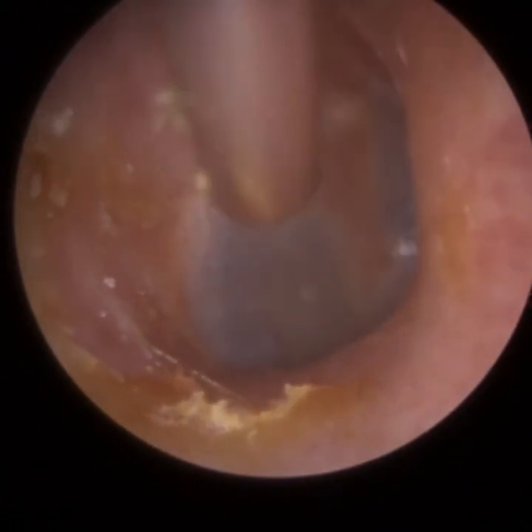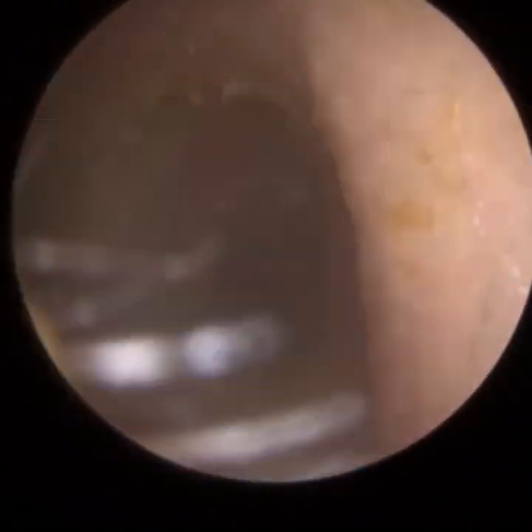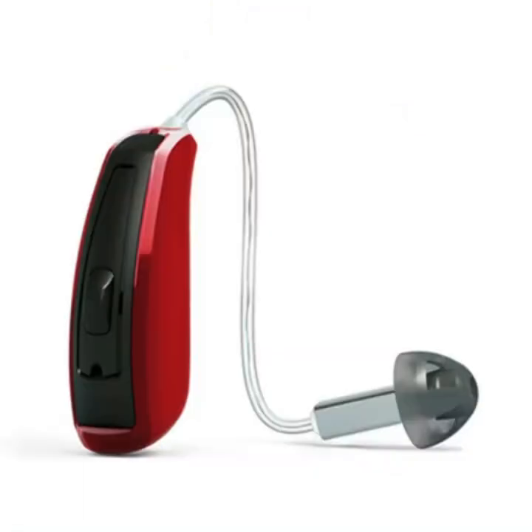Ironically, when we do our Clear Wax training course, I actually put domes in each delegate's ear so the other delegate can remove them. It's part of our training course to remove a dome from someone's ear, because it happens more often than you think. When you're removing a dome, typically you can't use microsuction — you'll have to use forceps or an earhook. Microsuction just won't cut the mustard.